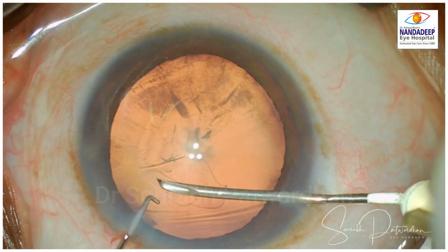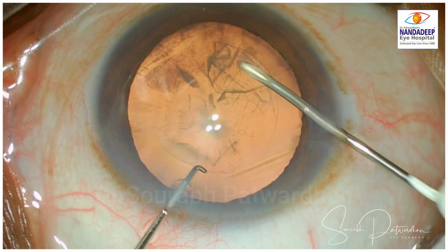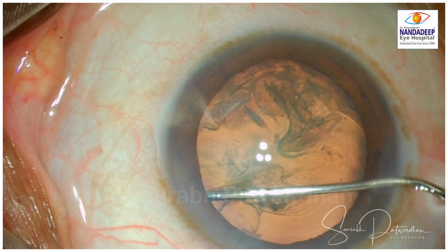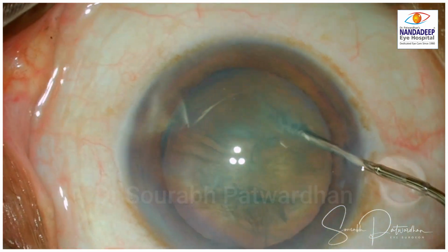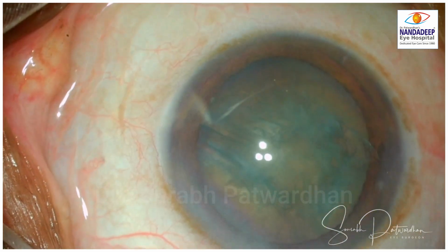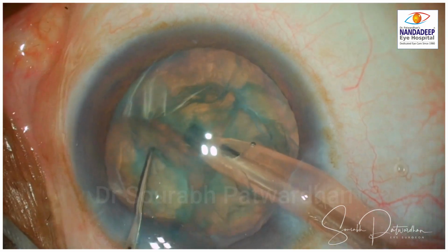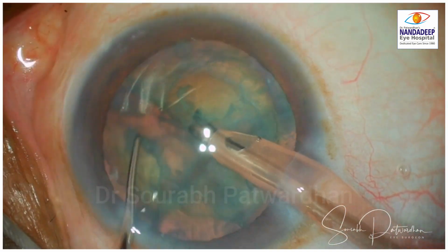A very regular case of phaco, grade 1 to 2 cataract, and good CCC. You can see during CCC there were no signs of any zonular weakness, a good cortical cleaving hydrodissection, followed by chop and emulsification of the pieces. All throughout the surgery I looked for any signs which suggested that there could be zonular weakness in this case.